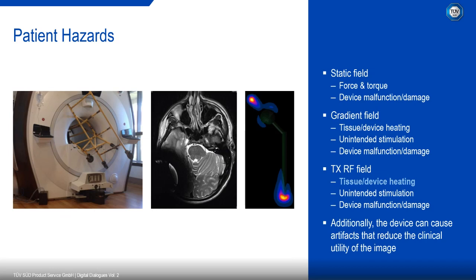The 3 electromagnetic fields expose several hazards to the patients wearing medical implants which contain magnetic or metallic components. As an example, the induced force and torque due to the existence of the strong static field is a risk to the safety of the patient. Specifically for large metallic implants like orthopedic implants or those which are in the proximity of a soft tissue, the left image shows the power of a scanner magnet deforming the metallic ladder in the MRI room in a clinic where the allowed proximity to the scanner for metallic objects is ignored.